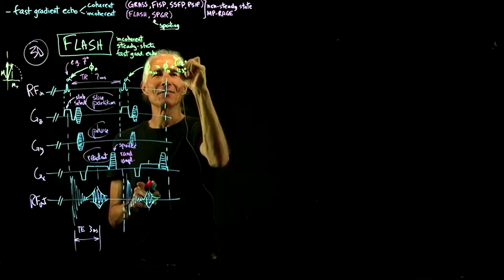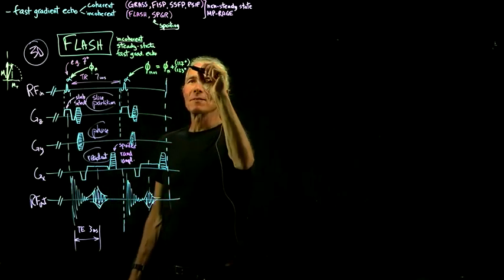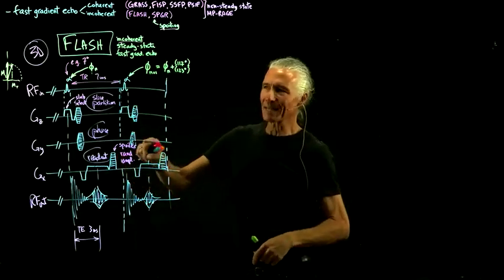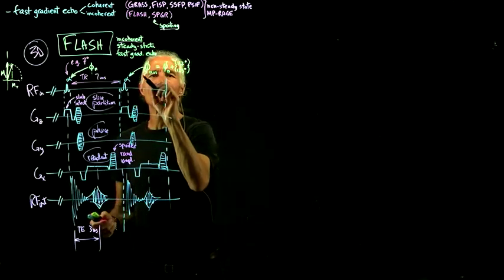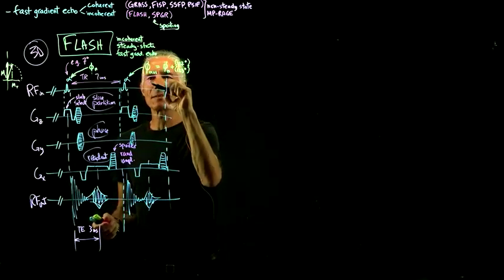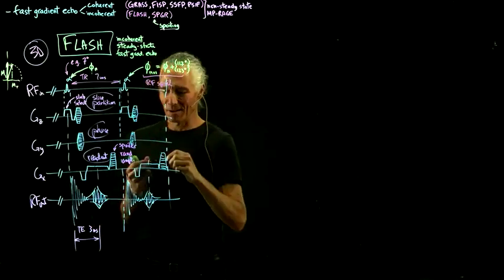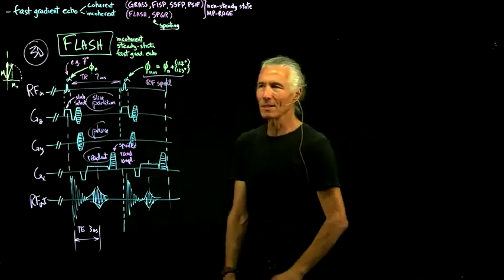So, one of those. If you do that, you have the best chance of messing up and spoiling your phase from the previous one. And this thing is called RF spoiling. So we do that too. And that's available on the scanner. You can click it off and see what happens. The images don't look as good.